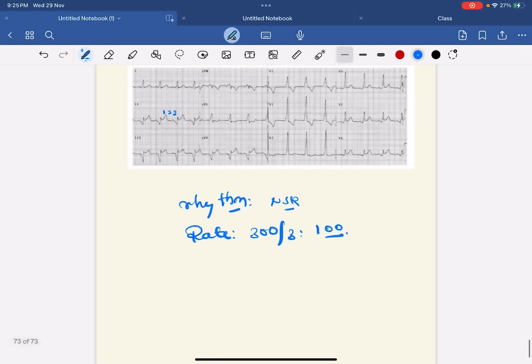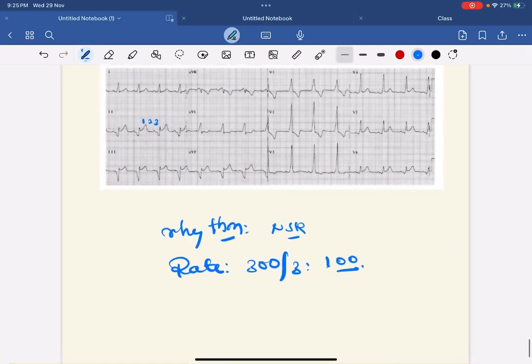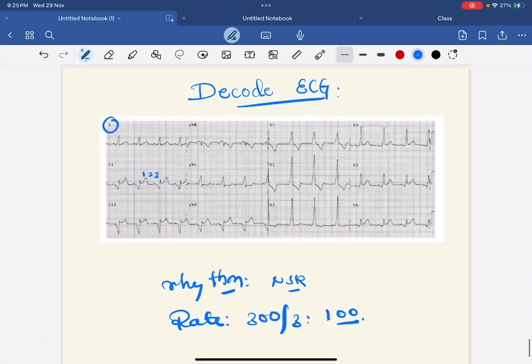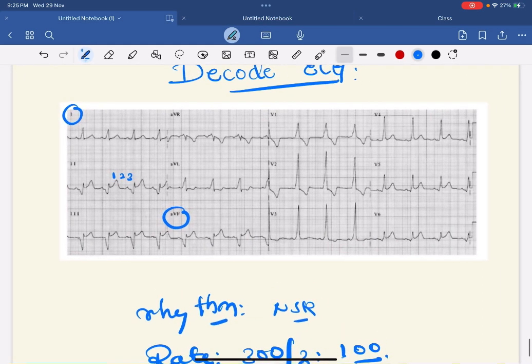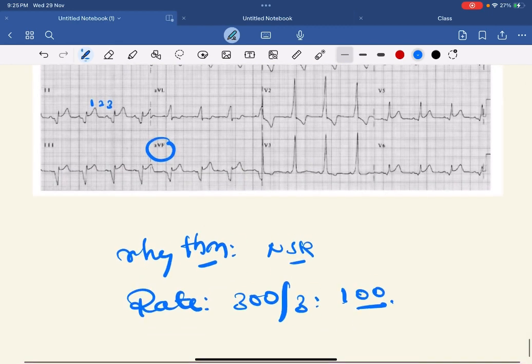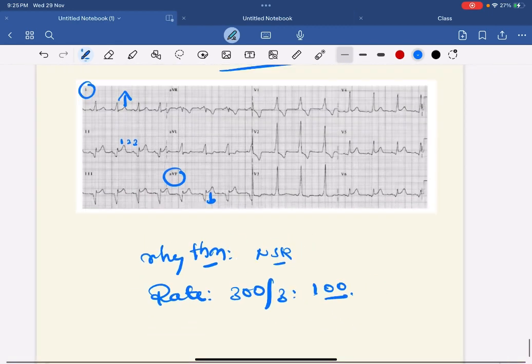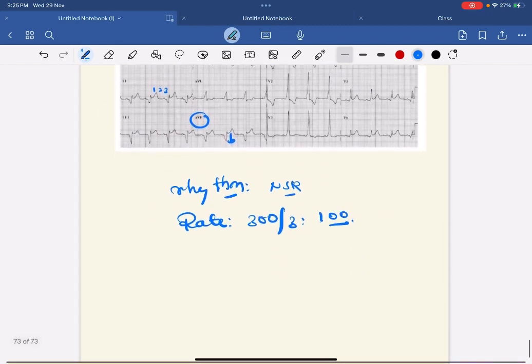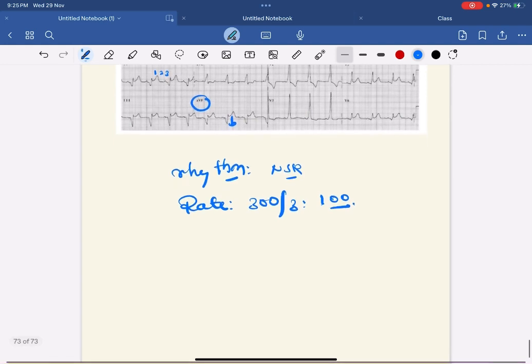After calculating rhythm and rate, you have to calculate axis. For that you have to see lead I and lead aVF. In lead I the QRS is predominantly up. In lead aVF it is predominantly down. So both are leaving each other, so the axis is left axis deviation.